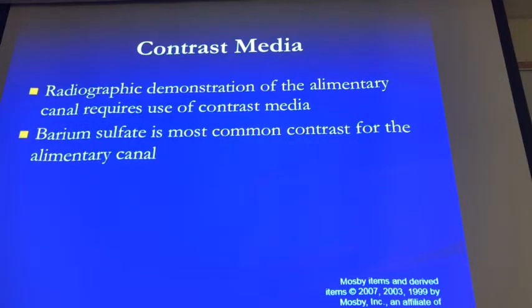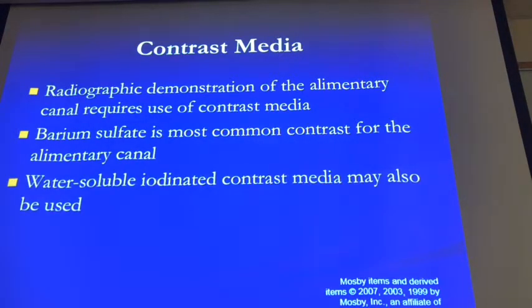Next semester, once again in 415, I'll go into all the details of why it works. But for now, just remember that it's because it has a higher atomic number. Are we good? All right. Sometimes barium is not ideal, and it's not ideal if they suspect a bowel perforation.